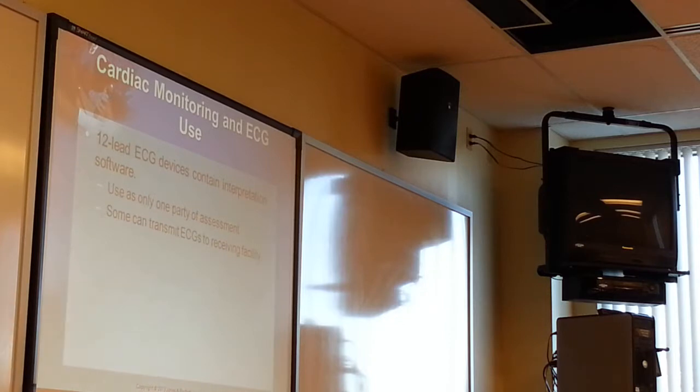With technology, we can get them to the hospitals if the cell towers are working. The problem with sending a 12-lead EKG is, guess what? If their printer isn't set up right, they don't get the right capture of the 12-lead. When I called Bryn Mawr Hospital, I said, I'm sending you a 12-lead EKG. Oh, it was on portrait, not landscape. Some of these things you can't make up. When they look at it, they only get a small picture of it.